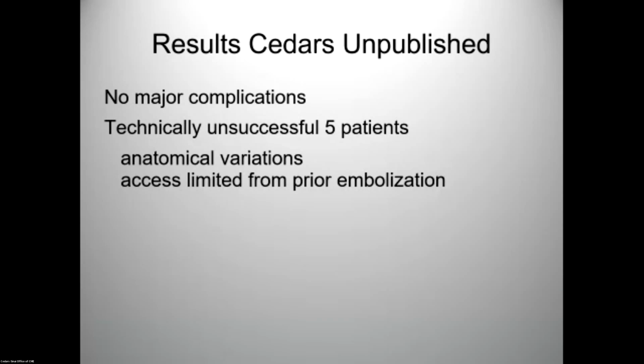Technically unsuccessful in 5 patients. Anatomical variations I like to blame too. One of them, for sure, access was limited from prior embolization. And there is a learning curve early on. Maybe some of the cases were due to my learning curve.